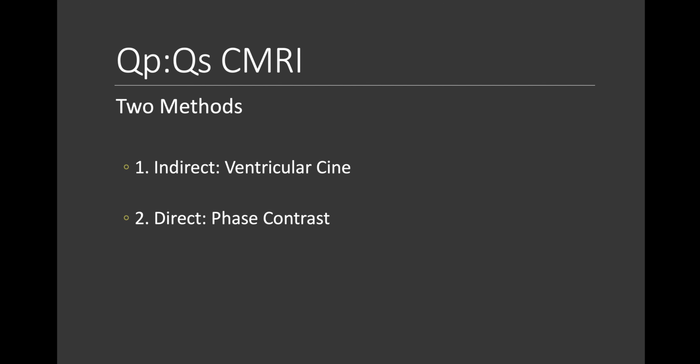In a normal subject, pulmonary flow has to be equal to the systemic flow. So if the net flow of blood going in the pulmonary artery is 1 milliliter, then 1 milliliter is going in the aorta to the systemic circulation. This is an important fact, and based on it we can understand the numbers that we add to our reports regarding stroke volumes, forward flow and backward flow.